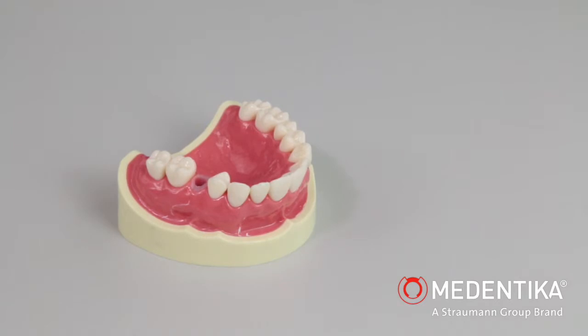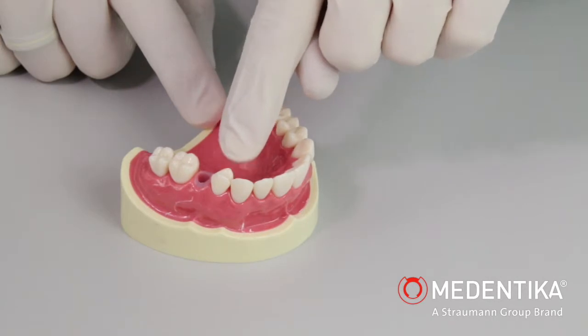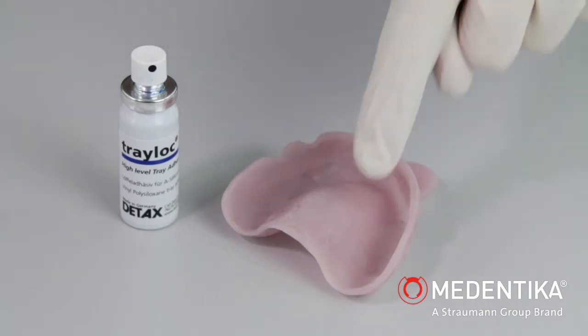We will demonstrate taking a closed impression. The basis is a microcone implant from Medentica placed in the region of tooth 25. We are using a custom tray fabricated in advance for taking the impression. The custom tray is sprayed with an adhesive to improve the bond of the impression silicone.